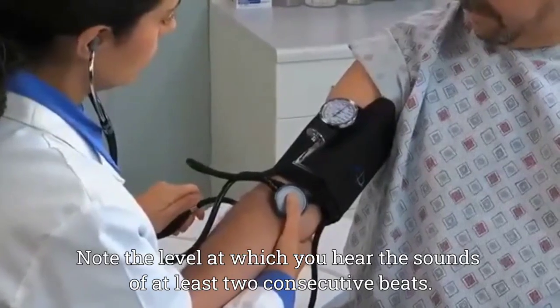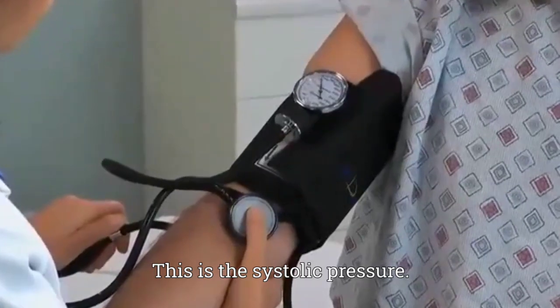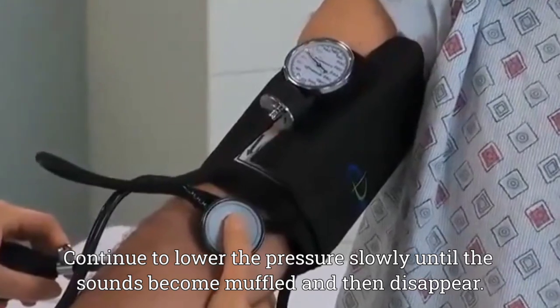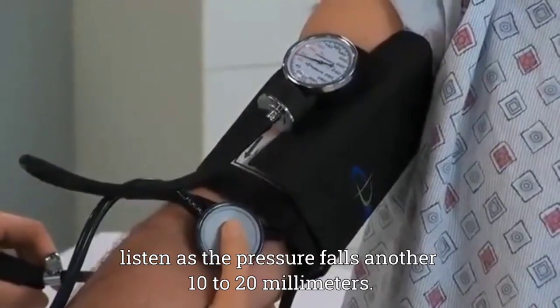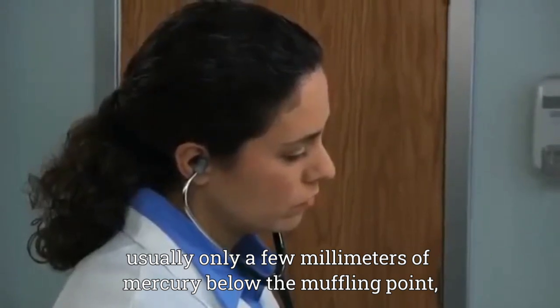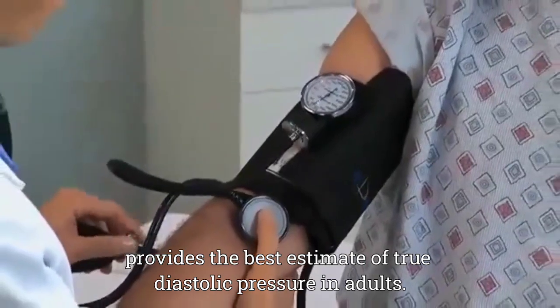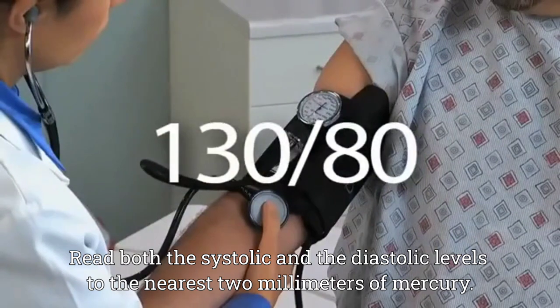Note the level at which you hear the sounds of at least 2 consecutive beats. This is the systolic pressure. Continue to lower the pressure slowly until the sounds become muffled and then disappear. To confirm the disappearance of sounds, listen as the pressure falls another 10 to 20 millimeters. The disappearance point, usually only a few millimeters of mercury below the muffling point, provides the best estimate of true diastolic pressure in adults. Read both the systolic and the diastolic levels to the nearest 2 millimeters of mercury.